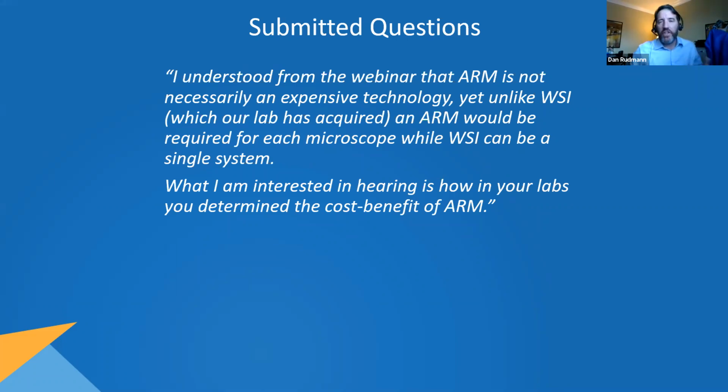So again, I think it's intended use. It's based on the structure of your company, based on your needs too. For instance, we looked at over 4 million tissues last year. So is it realistic to scan all 4 million tissues when really you only want to do image analysis and maybe AI on 10% of those? Is that worth all that time and money, right?